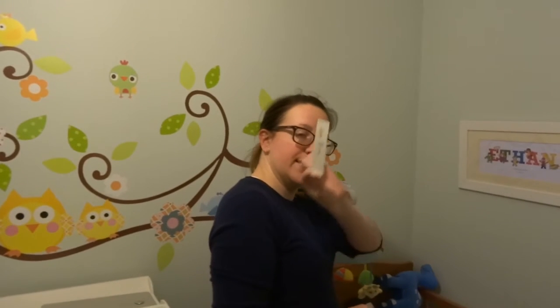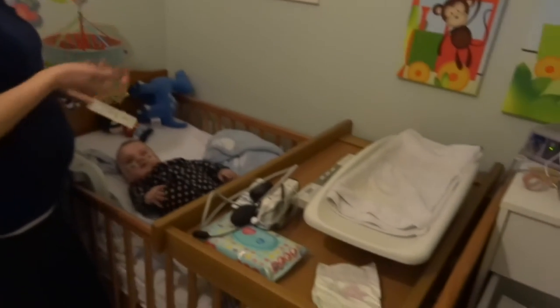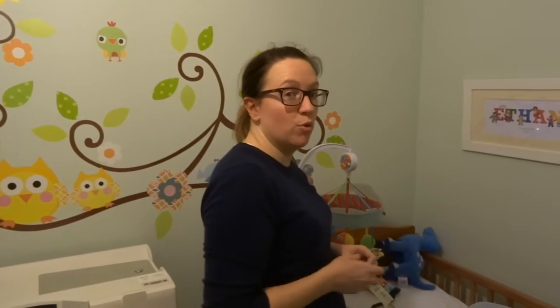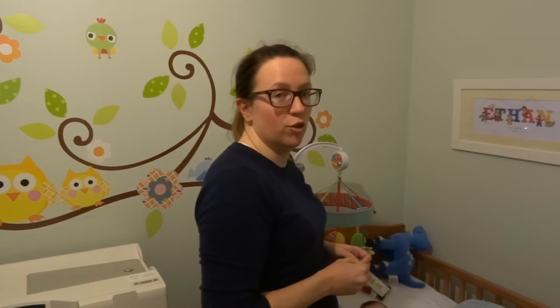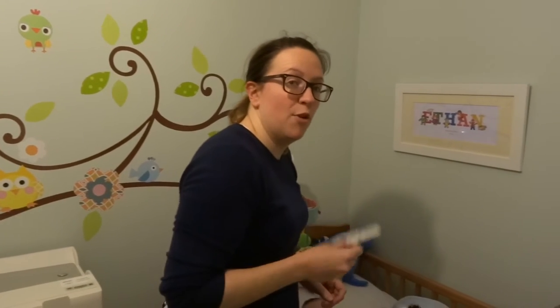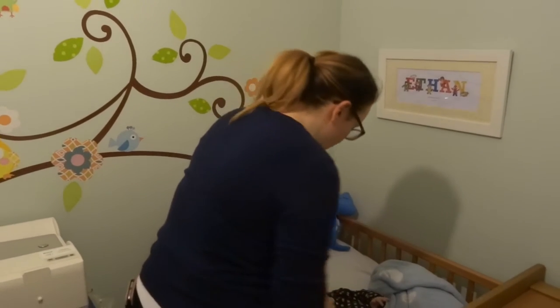The next part of the process is taking Ethan's temperature using a temper tot, his blood pressure, and weighing him. We do this every night and every morning to check that he's not taking on too much fluid and that his blood pressure is stable. The weight tells us if he's putting on too much fluid. Temperature is important too — if it's not okay, we need to be taking a sample to the hospital.